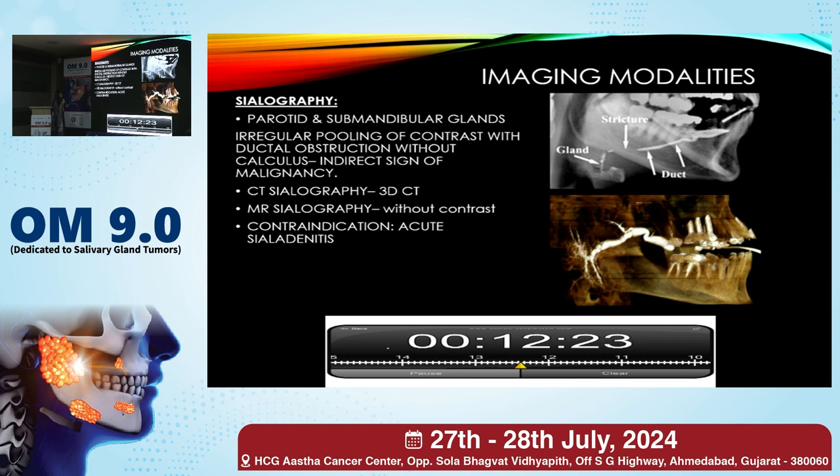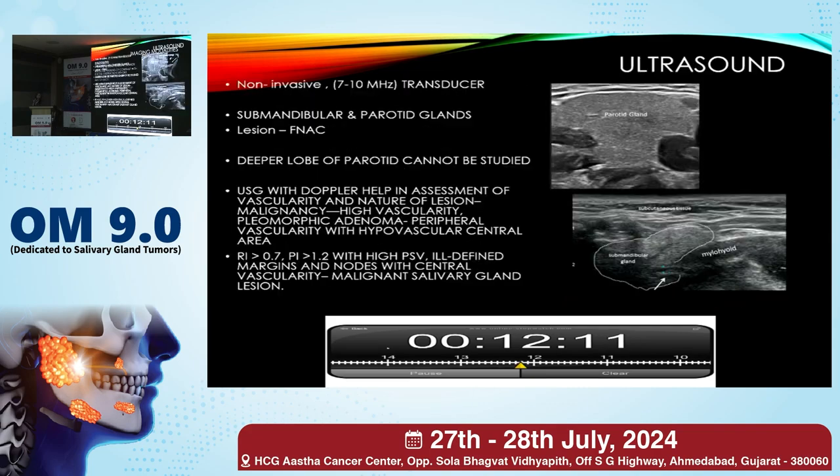Other than that, we can do CT sialography. We can do MR sialography, which is done without contrast. The conventional sialography is contraindicated in patients with acute sialadenitis.